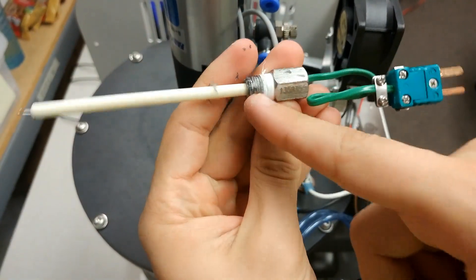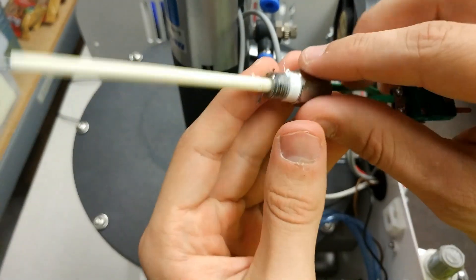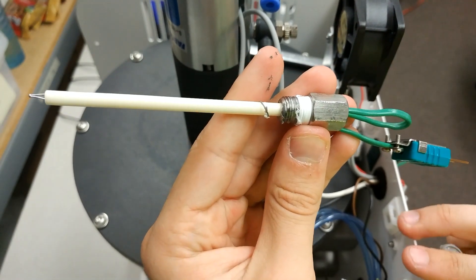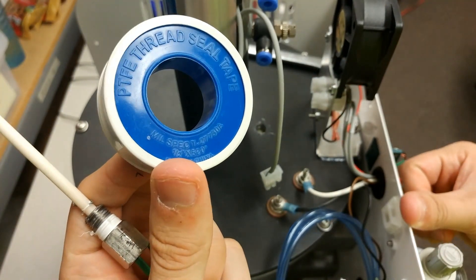If you're replacing your muffle and putting your existing thermocouple inside a new muffle, go ahead and take the white Teflon tape off of your previous thermocouple and grab your roll of Teflon tape. You can get this Teflon tape at any hardware store in the United States, but it must be half inch wide.